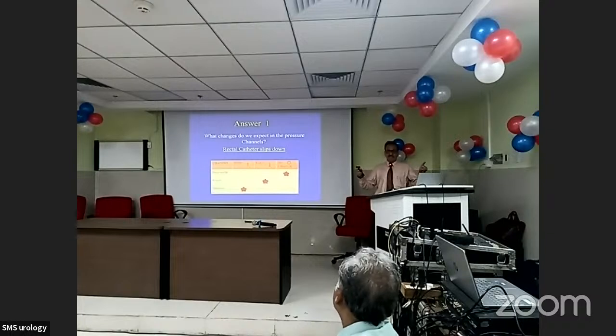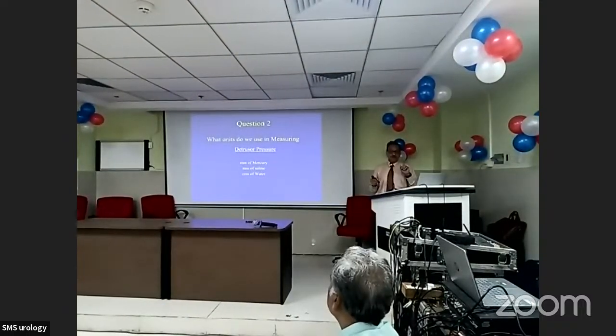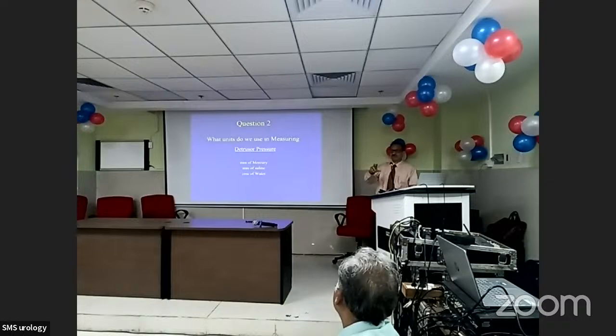So as long as you understand this basic logic of measurement of pressure, I think you have known half of urodynamics for this point. But this will also help us to interpret properly. When you're looking at the traces and interpreting, you're interpreting in the light of clinical picture. But clinical picture aside, first and foremost thing is, as Dr. Priyadarshini also told you, that correct measurement of pressure is an absolute mainstay of a good urodynamic evaluation. Pressure must be correct, rectal lines will be properly done. A good quality trace is an absolute must, and then comes the interpretation.